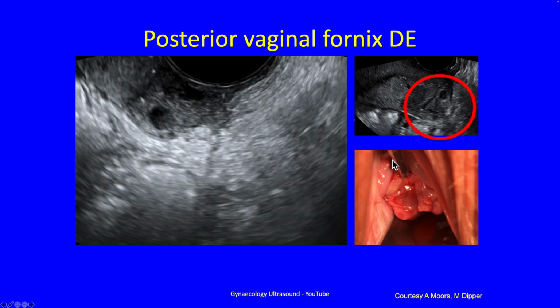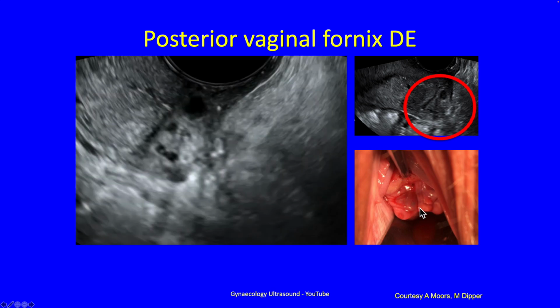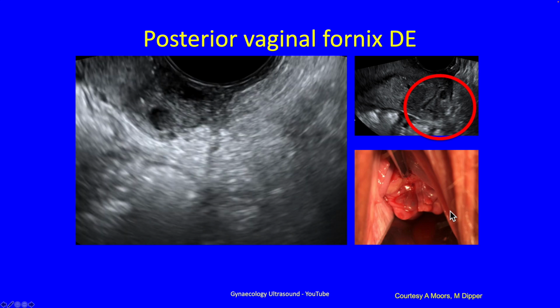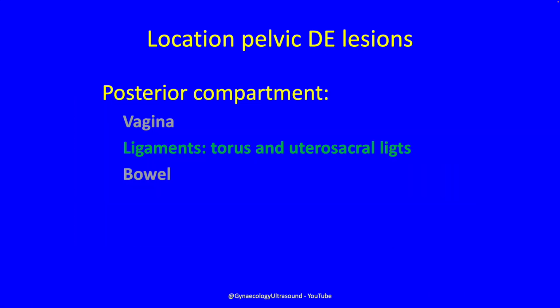And on a speculum examination, pushing the cervix out of the way, you can see it looks a bit like a blood blister. So even many gynecologists wouldn't recognize this. You have to tell them that you've seen it on ultrasound.